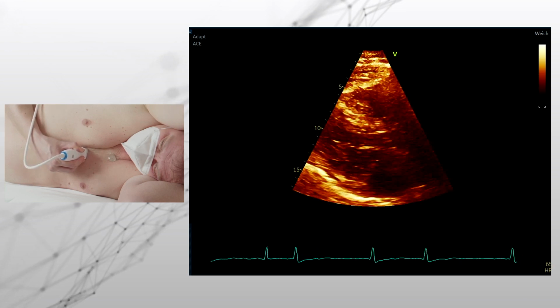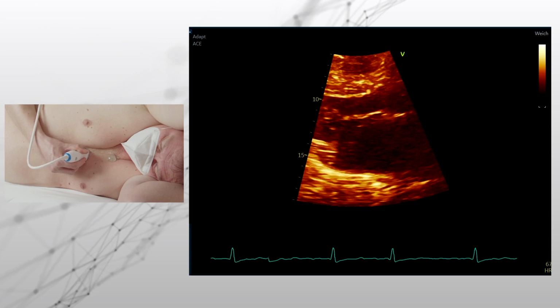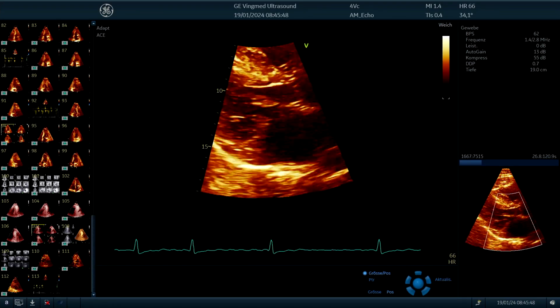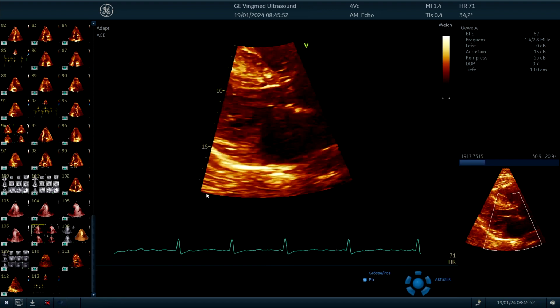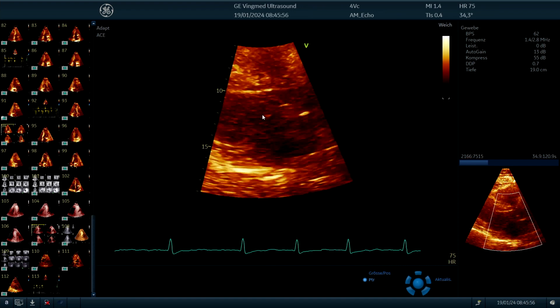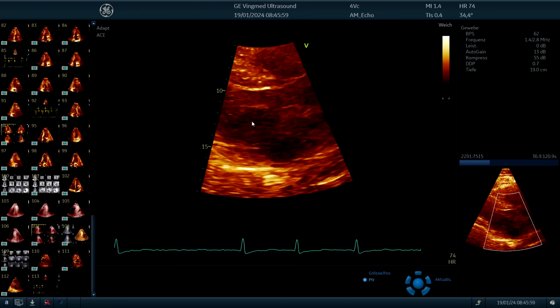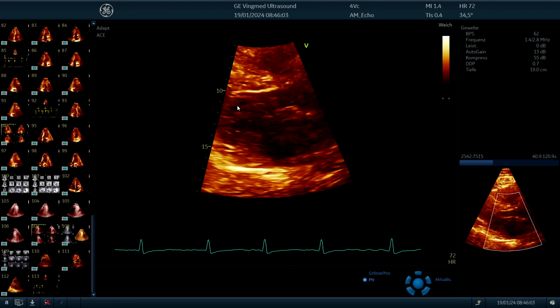Focusing on the valves, we have to zoom in on the valves. First of the valves is, in this case, because I see it now, the mitral valve. I see that the mitral valve looks overall normal. There is atrial fibrillation present, most likely; we do see it in the ECG we have, and also in how the overall heart and contraction is moving. And we do see one interesting finding.